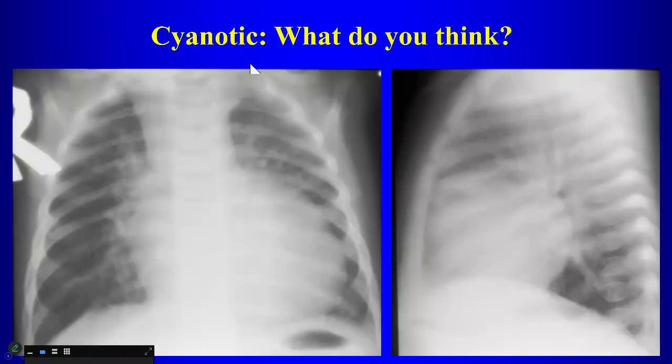So getting back to what we started with. The patient is cyanotic. We're in the category of the T lesions. The three biggies are, start with transposition because that's the most common, total anomalous pulmonary venous return, and truncus.